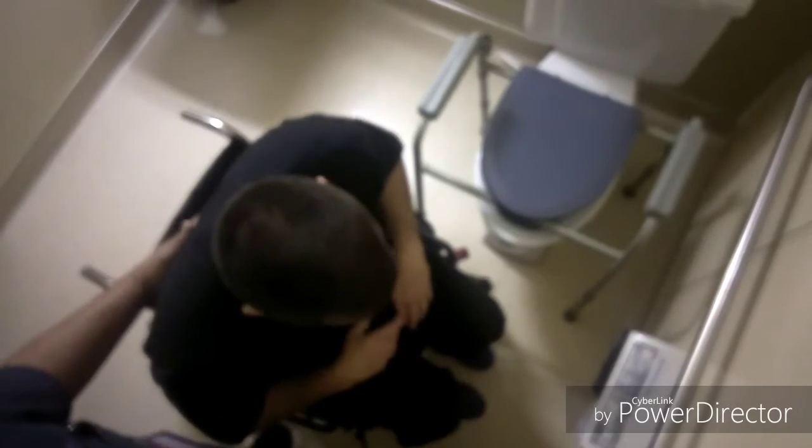So, lean forward for me and put your legs back. There you go. So I want you to kind of have your nose over your toes as you go up. Reach out for the bar, and then reach for the other bar. I've placed this gait belt on you so that I'll always have a nice grasp on. So I want you to push up from your arms, through your legs. Now stand. That's fine. Hold on to both bars. Hold on to the bar.